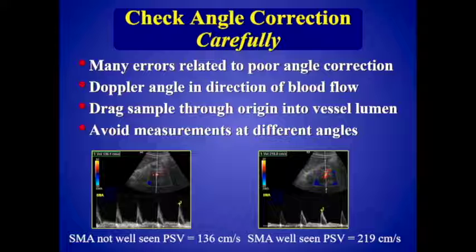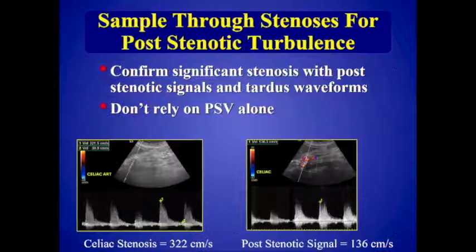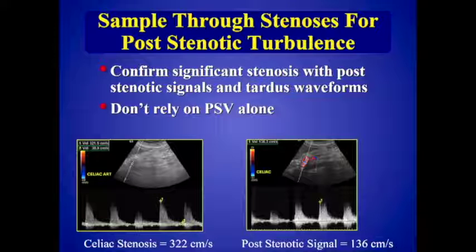Here's an example: when the SMA is not well seen, the velocity measures 136 cm/s, but when you extend the vessel and see the longer course, the velocity is really 219 cm/s. Always sample through the stenosis to look for post-stenotic turbulence. In this example, the celiac velocity is elevated, and as you move through it, you get that post-stenotic signal — velocity drops, bidirectional flow, a very shaggy waveform — confirming it's a flow-reducing lesion.